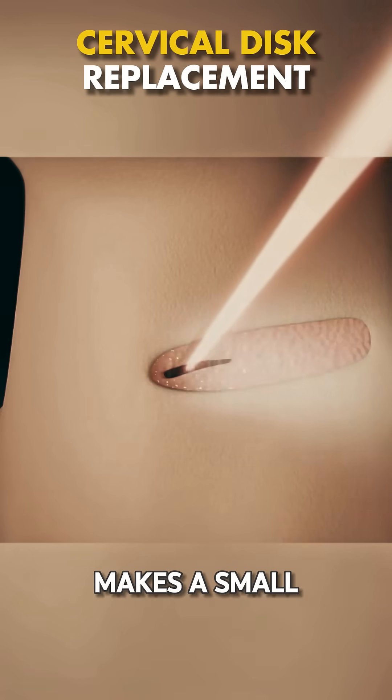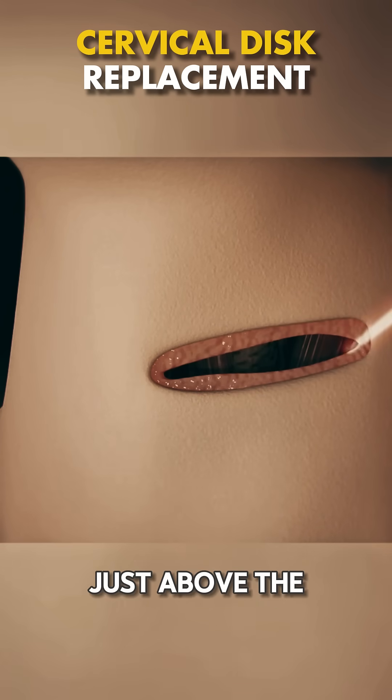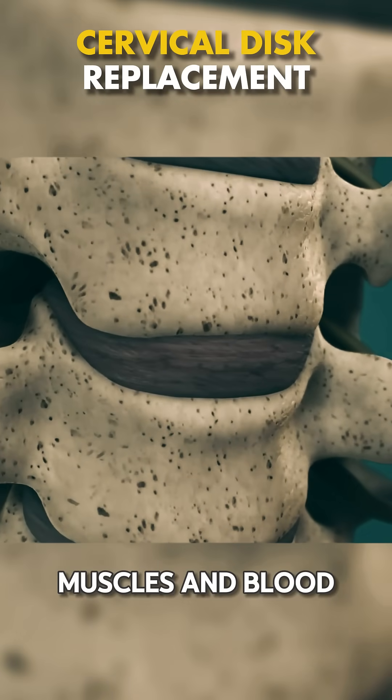First, the surgeon makes a small incision in the front of the neck, right here, just above the collarbone. This is where they access the spine while avoiding major muscles and blood vessels.